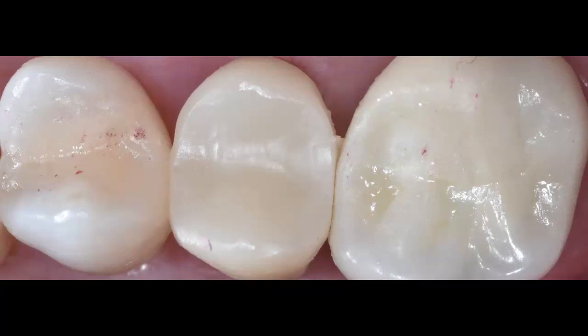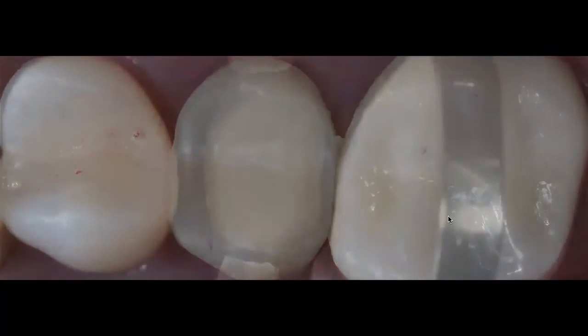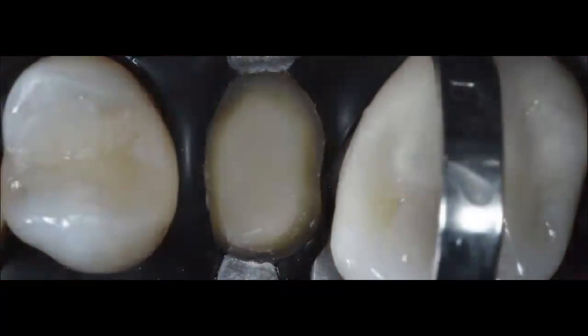I don't clean the Vaseline from the tooth. I just leave it there, and I use flowable composite to bond the temporary to the core buildup. It gives it a really good bond. Rarely do I have patients coming back for me to re-cement any temporary. This also allows the tissue to heal nicely, for them to clean, to do everything they need to do.